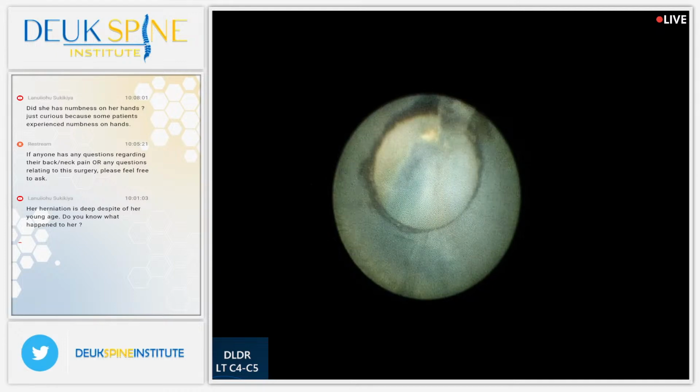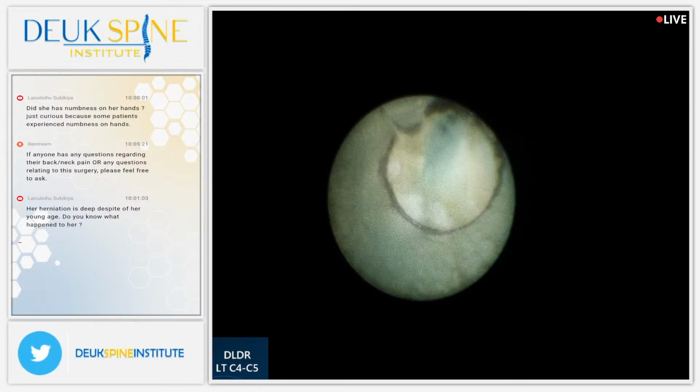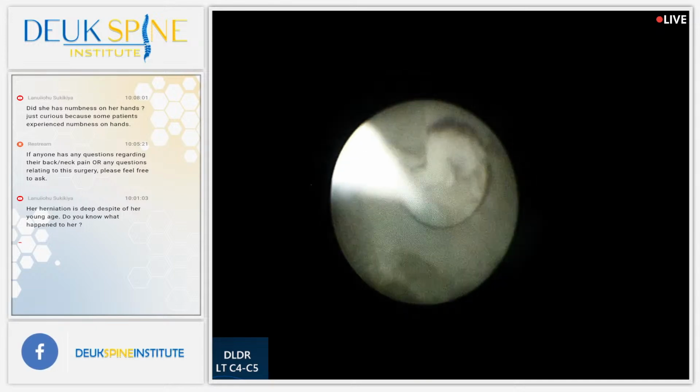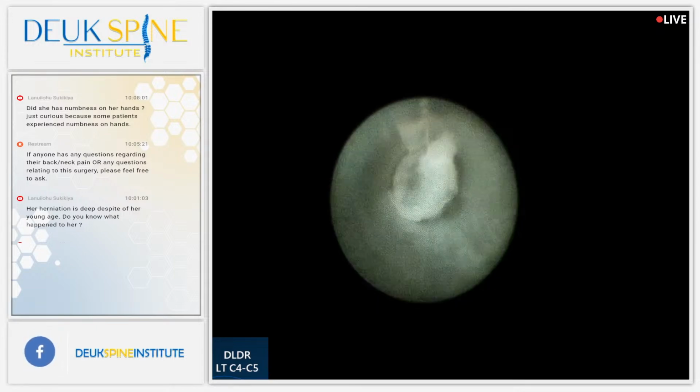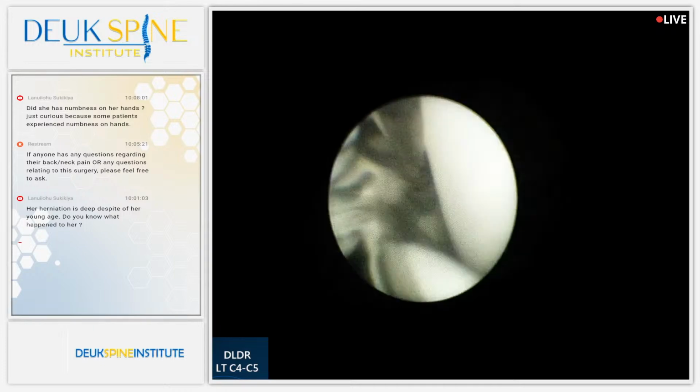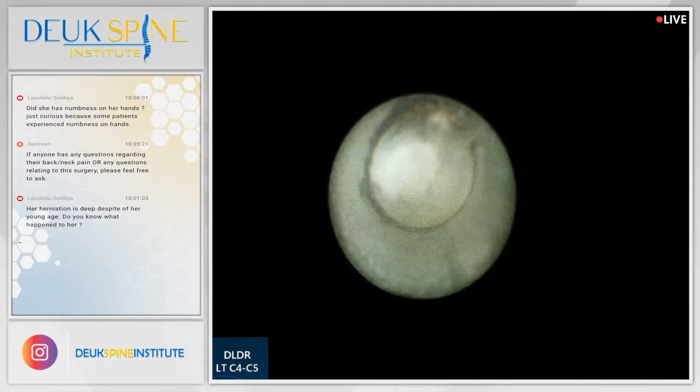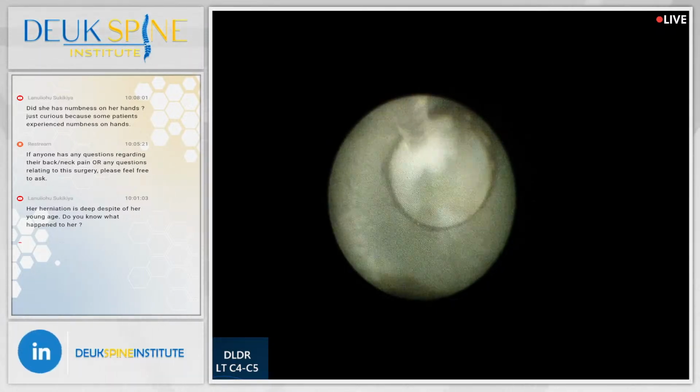And to get both hands, it would have to be the spinal cord affected that causes the both hand symptoms, okay? So there's another piece of herniation right there coming out. So all of these pieces of herniation I'm releasing with the laser are floating out through the tube.